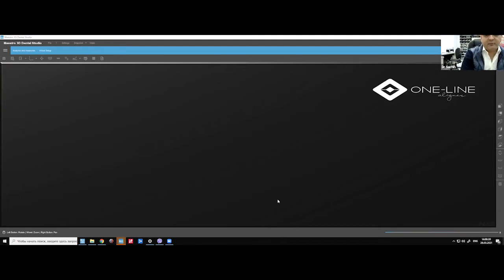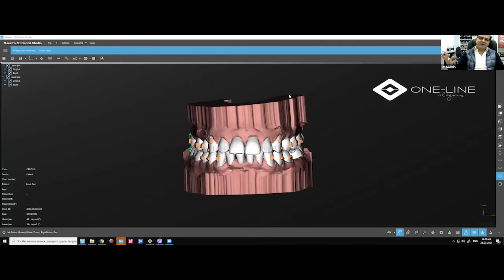Because this is actually a very difficult case, even for Invisalign, it's a difficult case for me. But the patient insisted on aligners, and for me it was a good chance to actually try my aligners to see, can we do bigger extraction cases with our setups, you know. Sorry, I'm just sorry.